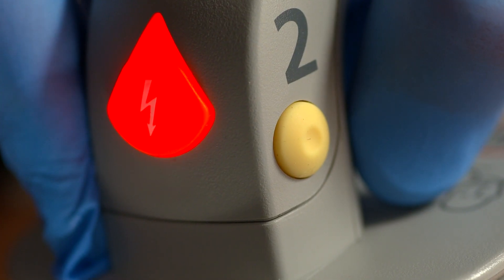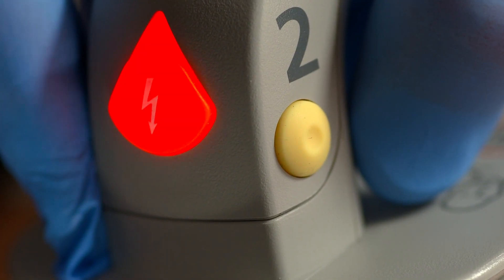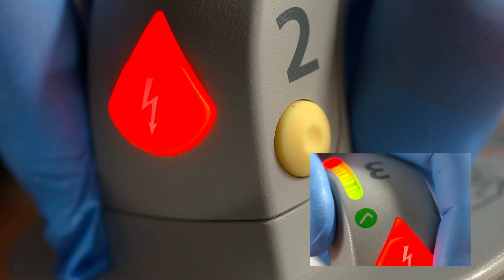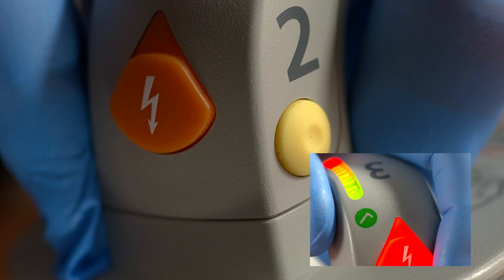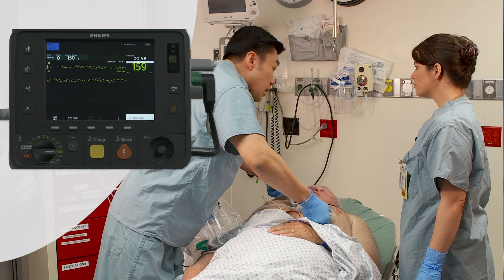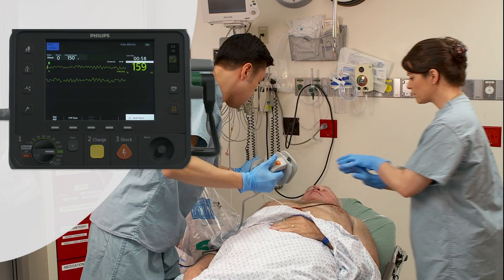The orange shock buttons on the paddles flash to indicate the defibrillator is charged, and the patient contact indicator lights turn green once proper skin contact is made. Make sure no one is touching the patient or anything connected to the patient. Press the shock buttons simultaneously located on the paddles.